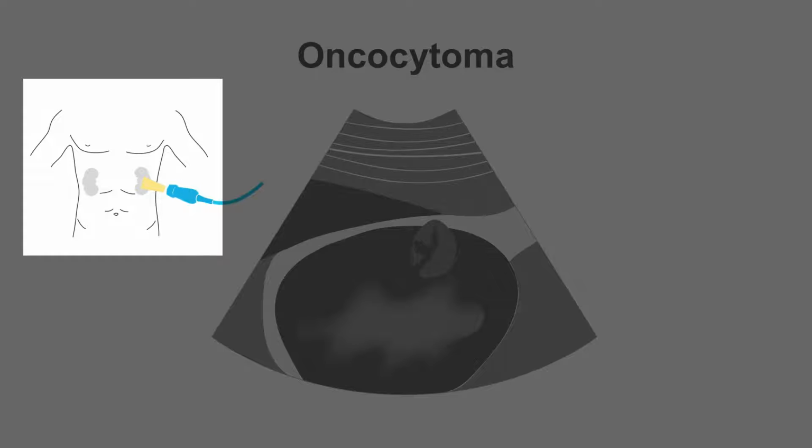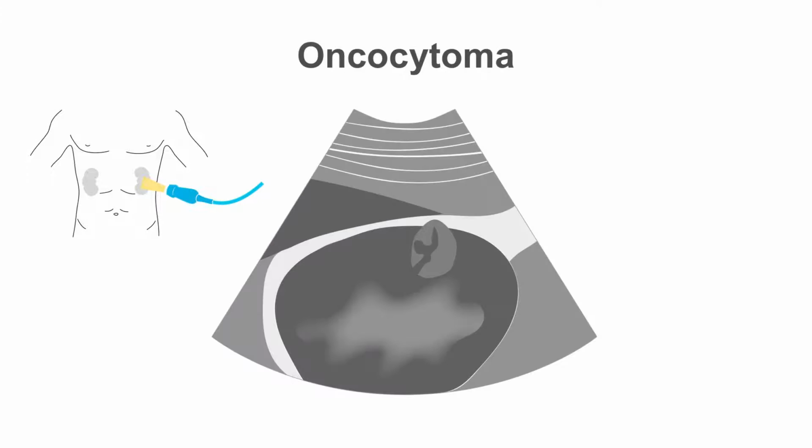We have a long section on the left kidney showing us the renal cortex and the spleen, as well as the renal sinus. We see a slight hyperechoic cortical lesion within the left kidney, showing a spoke wheel hypoechoic structure within the lesion. This is a presentation of a renal oncocytoma. They are relatively benign lesions, and the main clinical importance of this lesion is that it is hard to distinguish it from a renal cell carcinoma. Their presentation, imaging, and histology are sometimes very difficult to distinguish from one another.